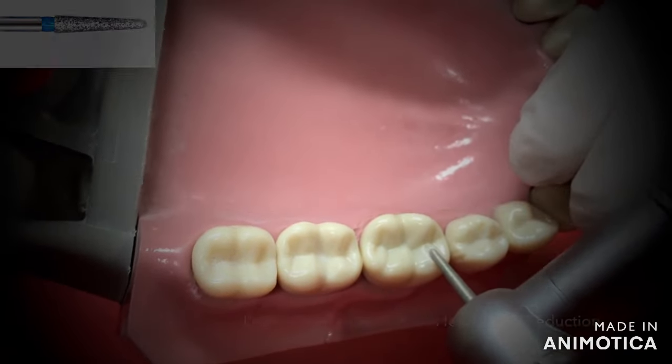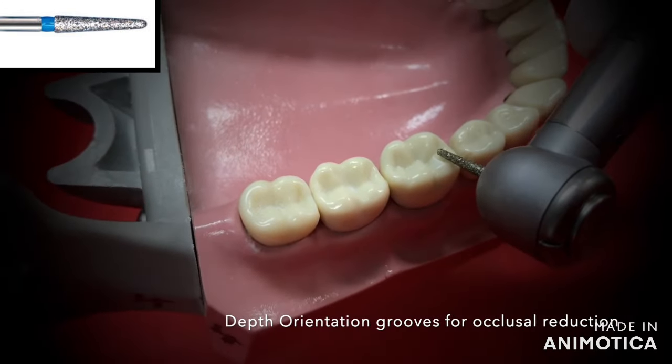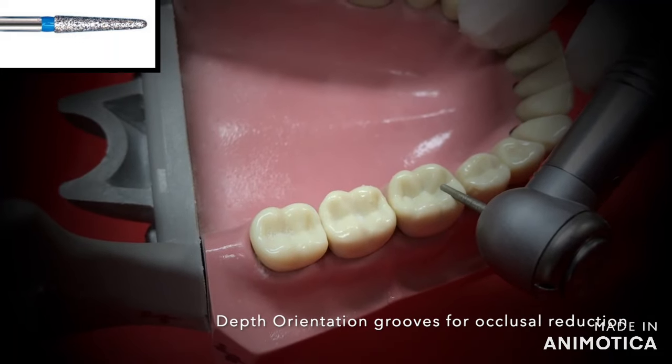Hello everyone! This is a short and concise video that I have made to learn correctly how to prepare a tooth for a crown. So let's begin.